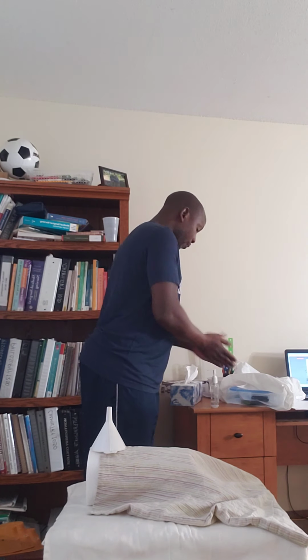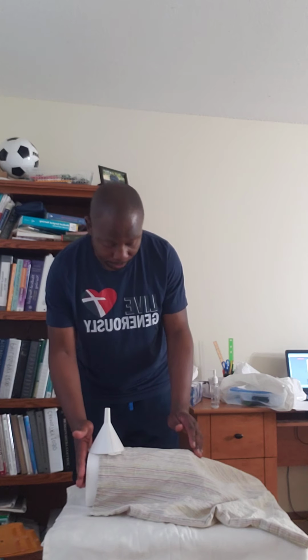After that, I wash my hands, and then I'll close the curtains to provide privacy for my patient. Then actually, I'm pretending this is the tracheostomy that is on my patient here. So it is here, and this is the head of my patient.